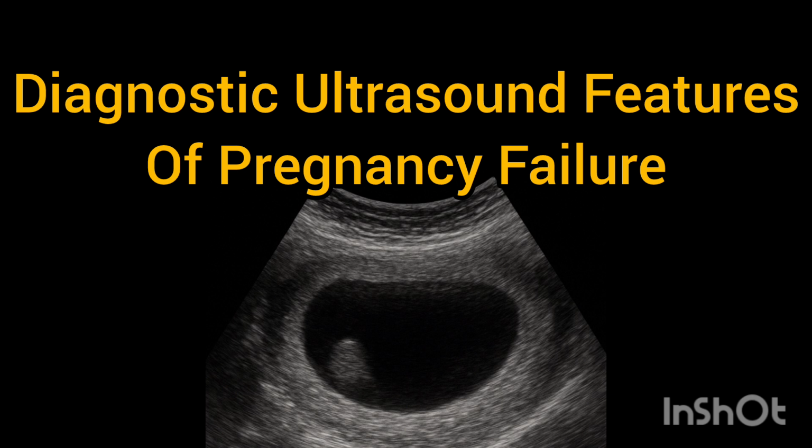In today's video, I will be discussing the definitive and diagnostic features of failed pregnancy on ultrasound. There are 4 features that are definitive in diagnosing a failed pregnancy.